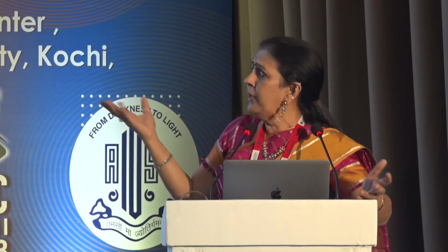increase. But the surgery has sort of got completed, and I have not yet placed a CTR, because the fact that the fragments are coming forward means there's no vitreous there. But look at the capsular bag, how lax it is. Do I place a CTR now itself is a choice. I push in viscoelastic, which stretches the capsular bag.